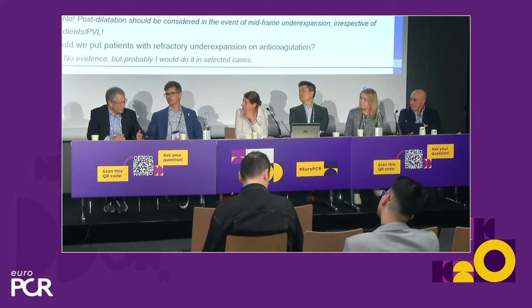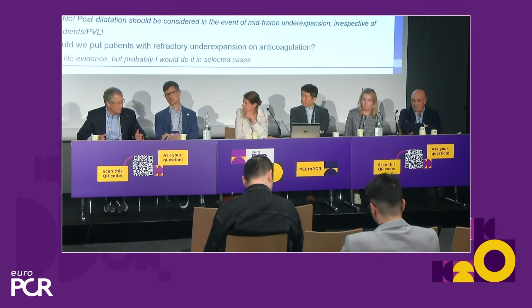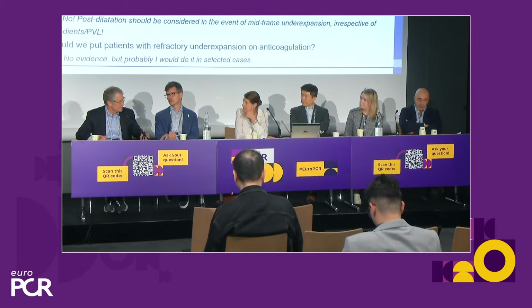And we do it in the middle of COVID, where we're doing one Accurate every 3 months, and we're doing commercial valves every single week. And so there's a real difference between how these trials were done and trying to compare it against other trials. It's not like we had an opportunity to learn this valve and then move to lower risk. And so I think that's the big difference.